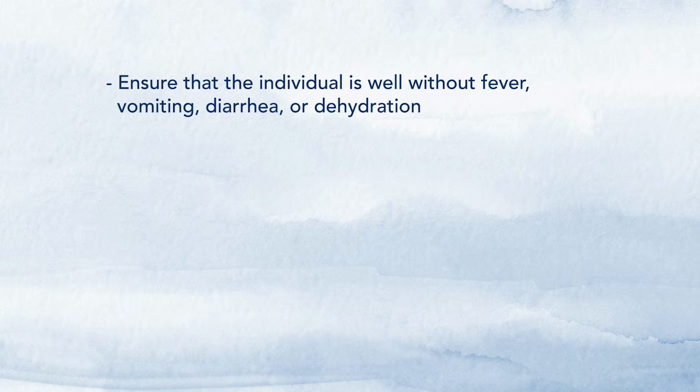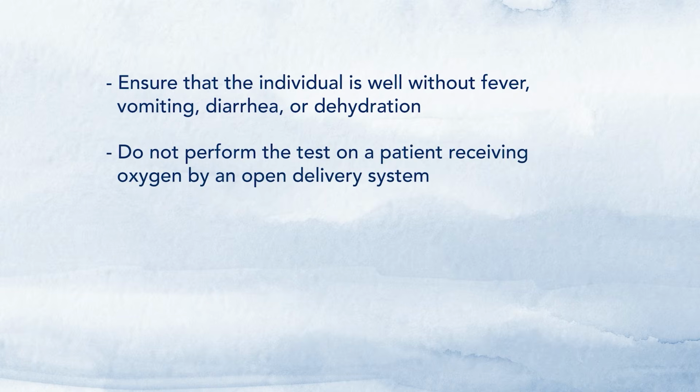Sweat testing may also be done for people with CF who take CFTR modulators to monitor how the medication is affecting their sweat chloride levels. Some important things to keep in mind before starting the sweat test are: ensure that the individual is well without fever, vomiting, diarrhea, or dehydration. Do not perform the test on a patient receiving oxygen by an open delivery system. Oxygen may be delivered by nasal cannula during the procedure if needed.